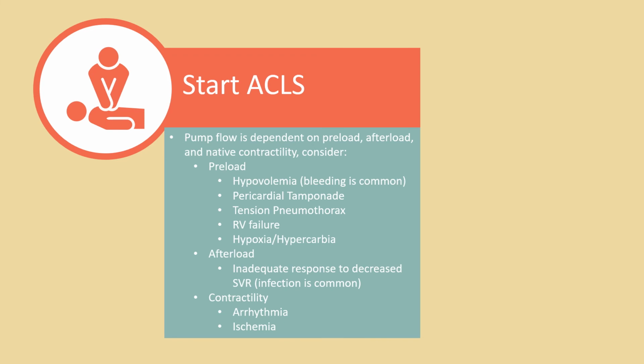In contrast, someone who's got good RV function, and the VAD's only mildly augmenting their LV function, may present quite dramatically. Similarly, ischemia can lead to decreased ventricular function and lead to arrhythmia.